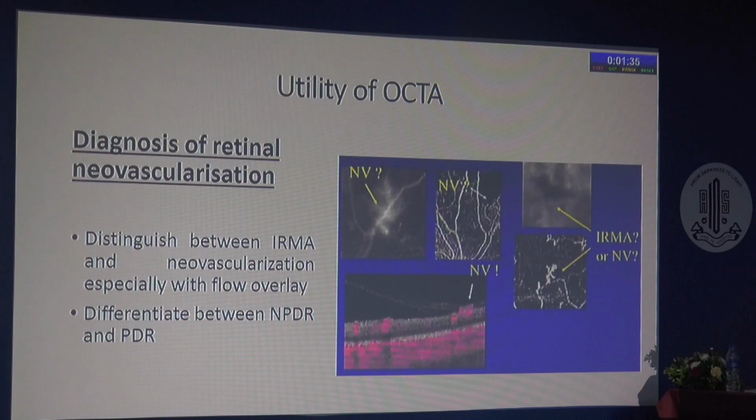So on a trial basis, they have made huge machines which can tap the whole retina end to end for angiography for trials. It's not commercially available, but they're even doing an OCT of the whole retina in ROP screening, and they can see the vessels coming up.